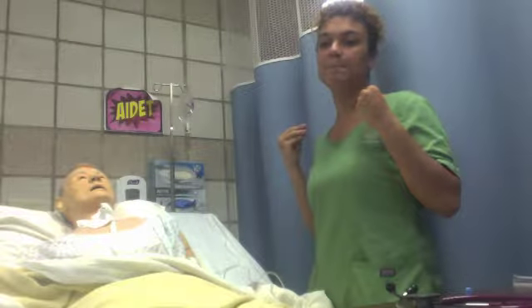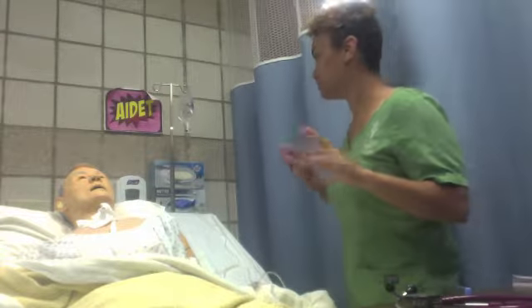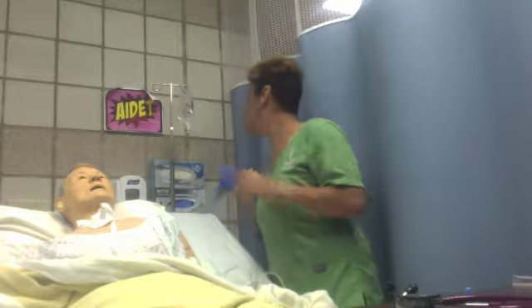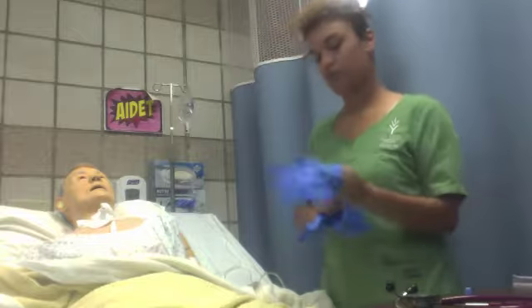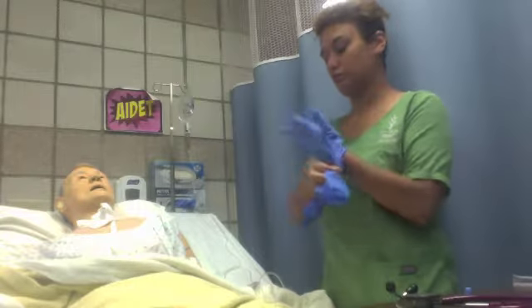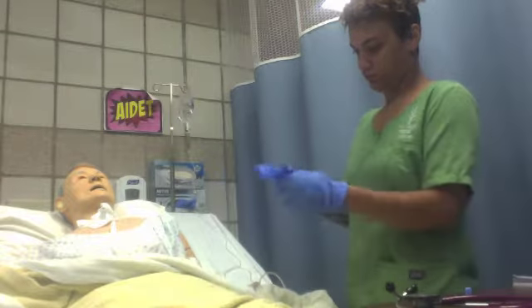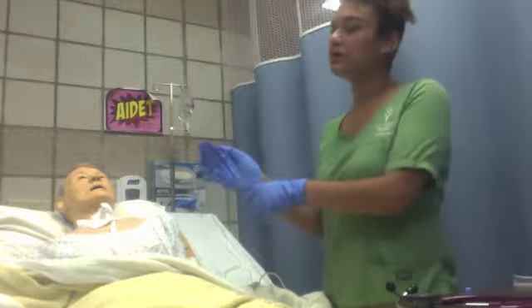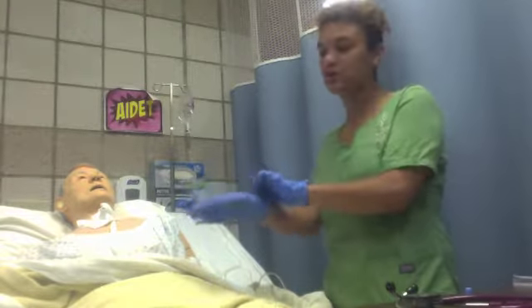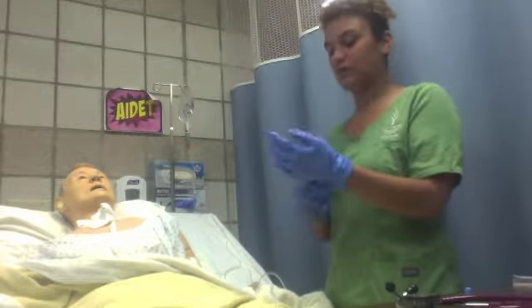So then once I'm in here, I'm going to take a look at everything. I'm going to just put on some gloves and take a look at everything. I'm also going to be trying to educate my patient the entire time about what I'm looking for so that they can notify their nurse with anything that they notice.